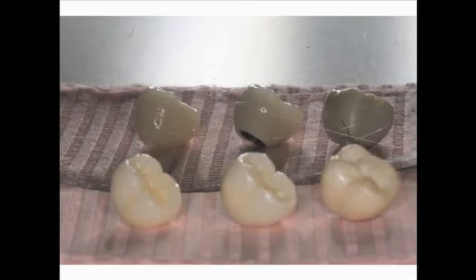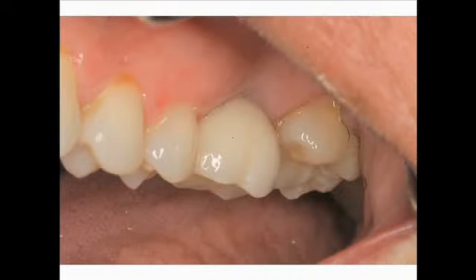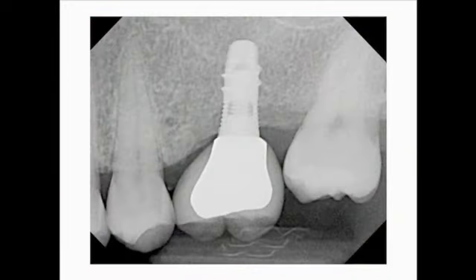Again, choices can be made on the type of crown that you want to use, whether it be a zirconia, a PFM, porcelain fused to metal, or a material used for bruxers like the bruxer solid zirconia material. Here, a zirconia crown was chosen for its aesthetics. This slide illustrates a porcelain fused to metal crown try-in, and you can see it's not quite as aesthetic as a zirconia crown. And here the bruxer material is very opaque and not very aesthetic, but very durable. And our last slide shows the final radiograph of the zirconia crown in place in the maxillary left first molar.